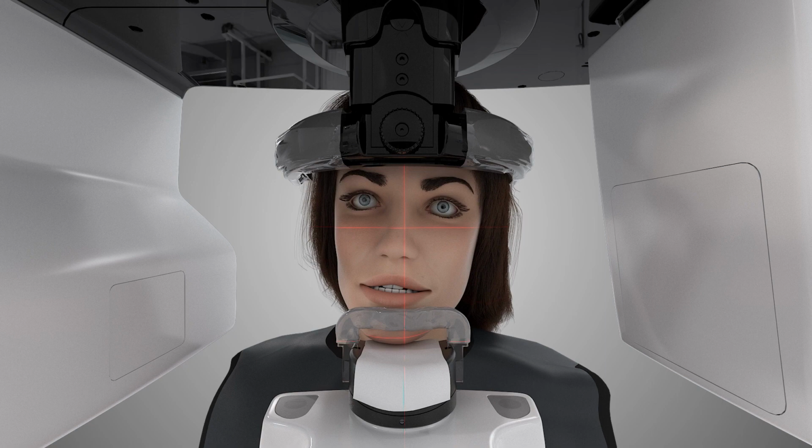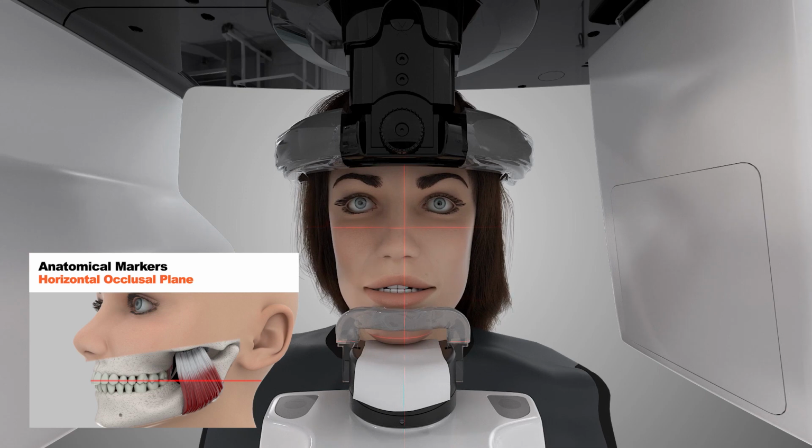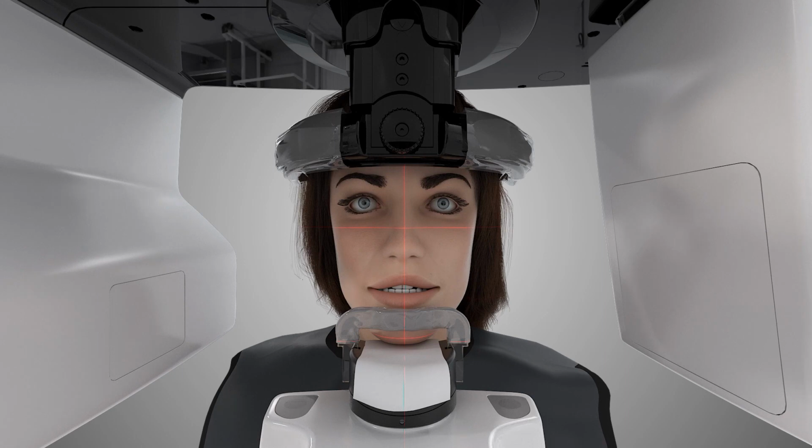3 lights will appear. Align the mid-sagittal laser light. This vertical line should pass directly through the center of the philtrum. Ensure the patient's head is not turned or tilted. Compensate for misalignments by manually moving the patient's head into the proper position. Ensure that the patient's occlusal plane is horizontal. Manually move the patient's head to compensate.